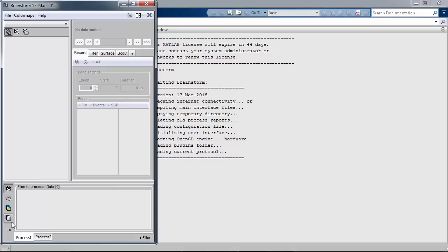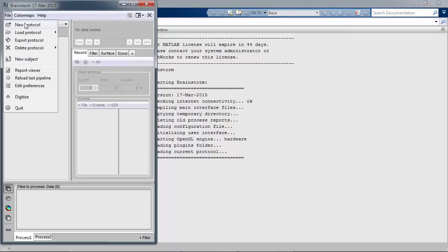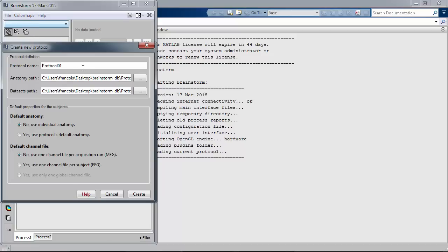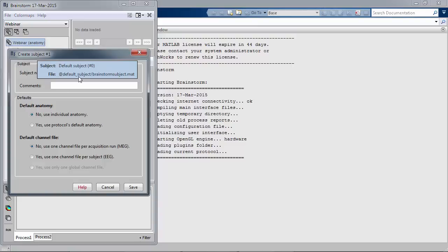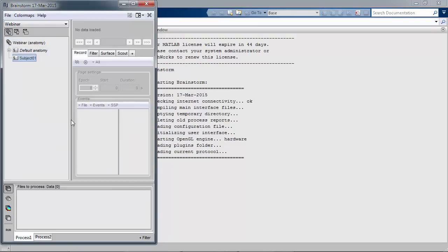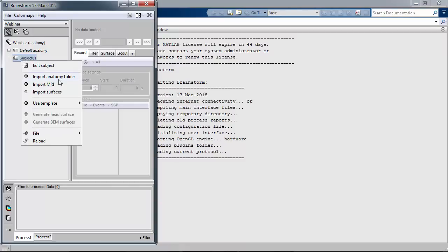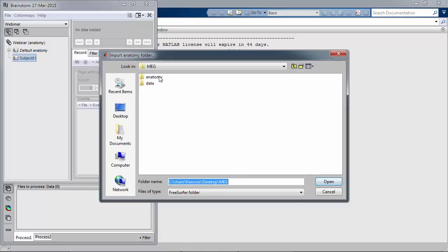To the right you have contextual and dedicated panels, and at the bottom is basically a data bucket where you can drag and drop elements from the database to run batch analysis. We're going to create a new protocol first. A new protocol is a new experiment — a set of data consisting of several subjects and participants. We're going to call a new subject, let's call it subject 1 by default. As we've seen in the slides, we need to import the anatomy of the subject using MRI.